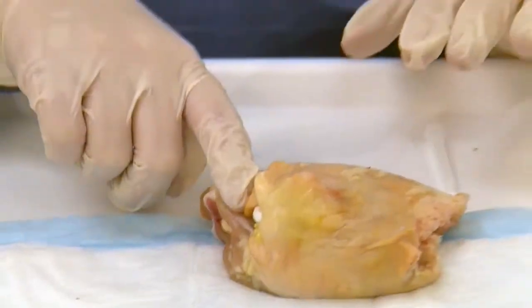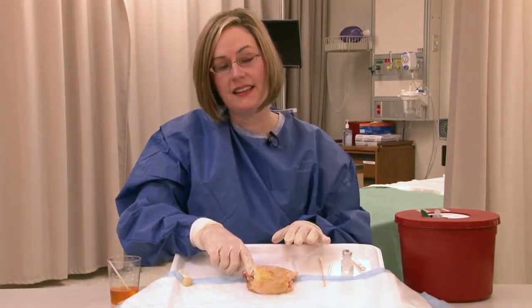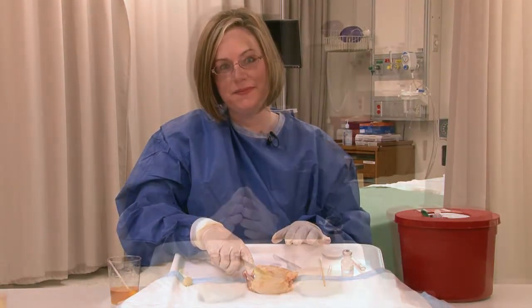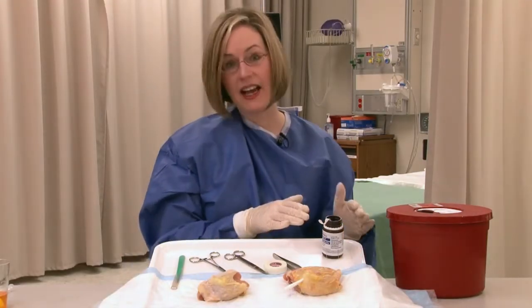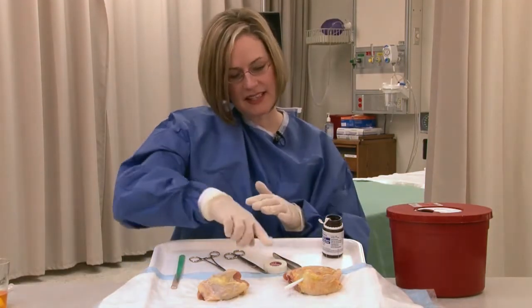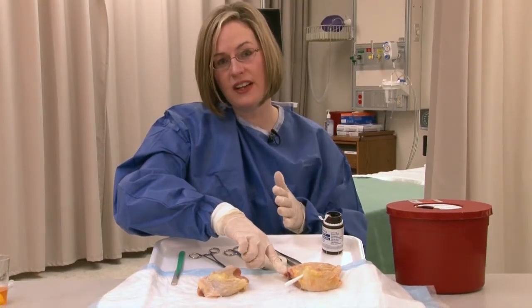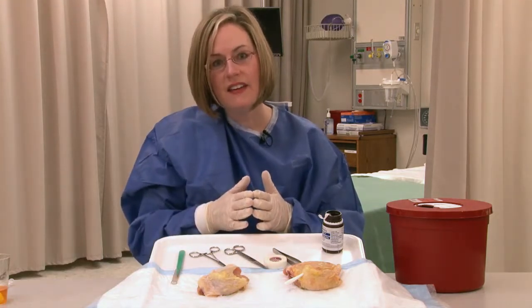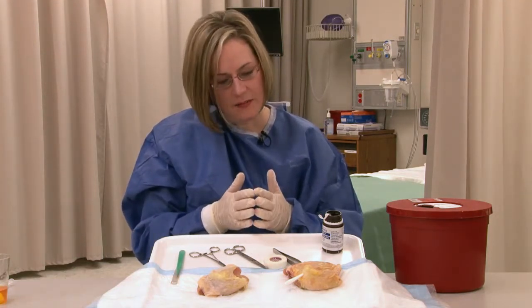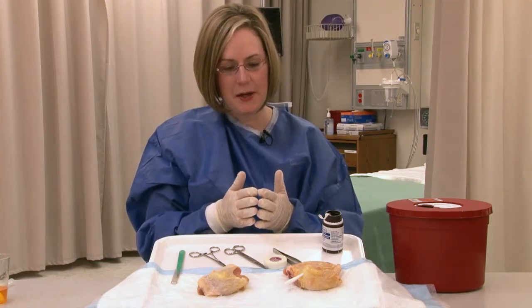And this concludes the incision and drainage and insertion of a Word catheter into a Bartholin gland cyst or abscess. Another way to simulate this procedure is to use iodoform packing in place of the Word catheter. Believe it or not, Word catheters are roughly $11 each. That's a huge investment for a school of nursing or for someone to just purchase to practice this procedure.